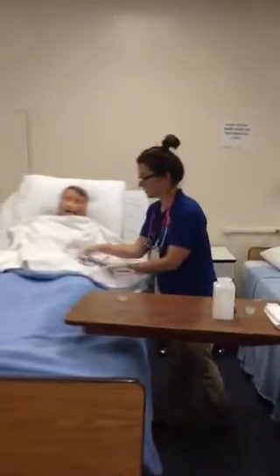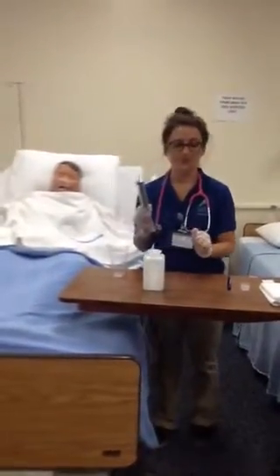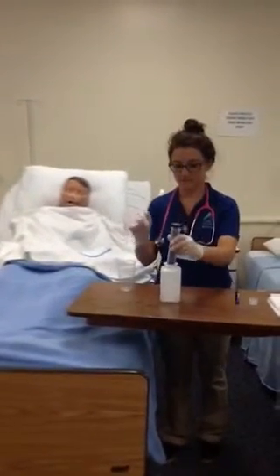Now I'm going to insert 30 milliliters of normal saline into the stomach.